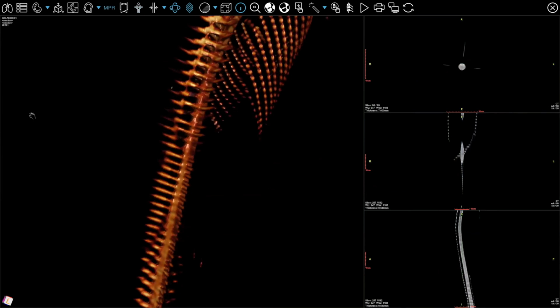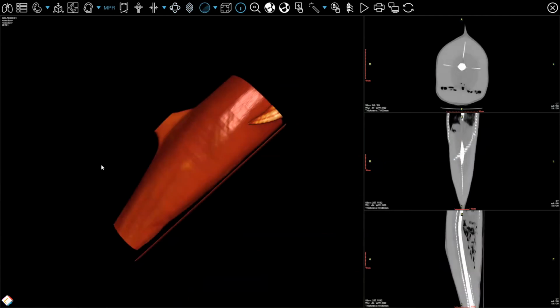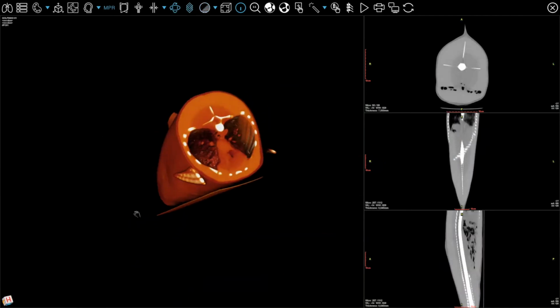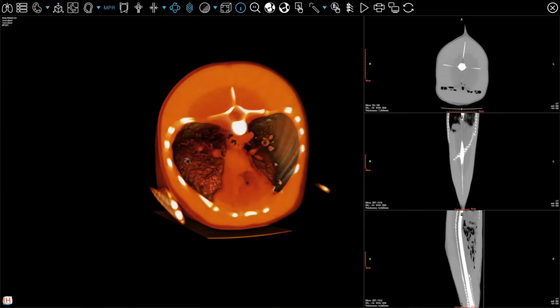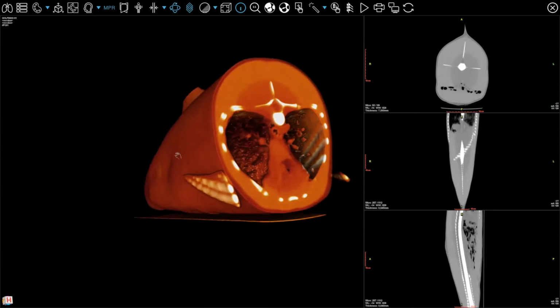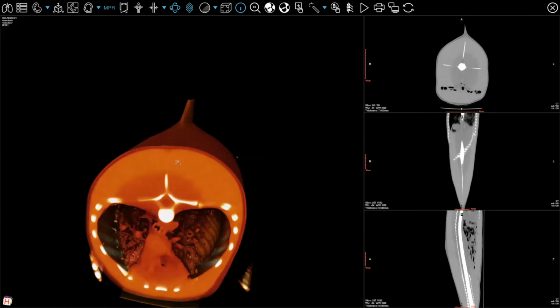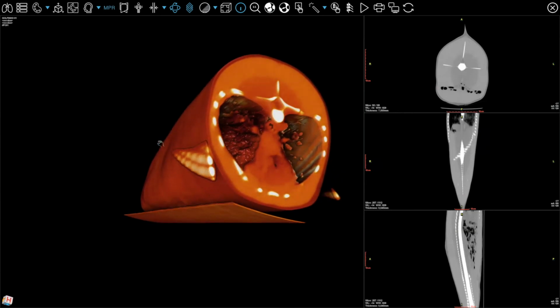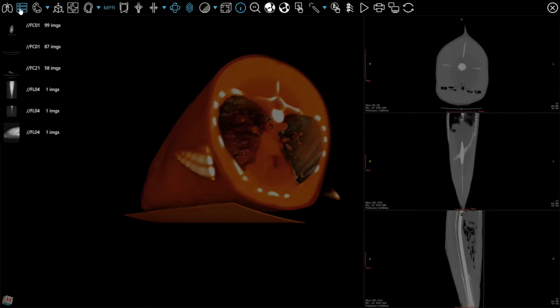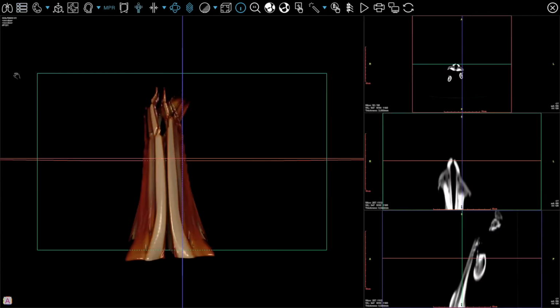We'll quickly show you the same structure for a dolphin. This is a CT scan of a dolphin that was found dead, and the government wanted to understand what happened with this animal. We were able to have the DICOM image of this animal, and you can see the body and how damaged it was inside from the oil that was in the ocean, which is quite interesting.